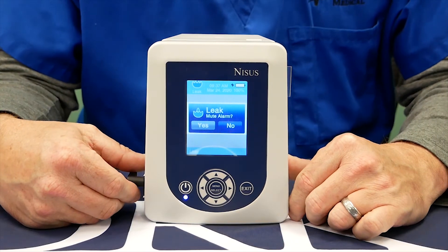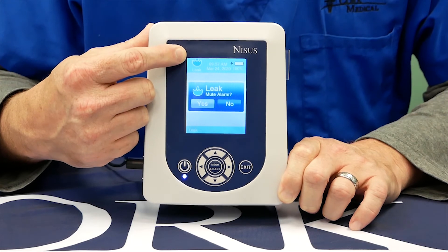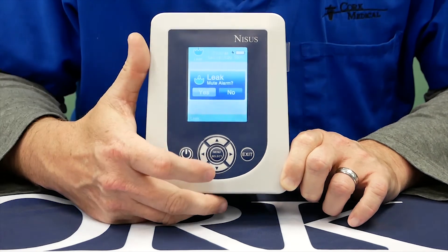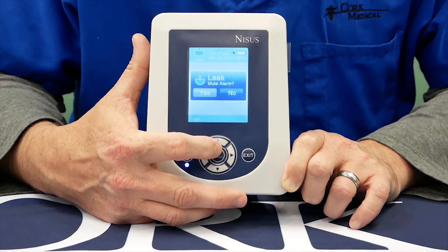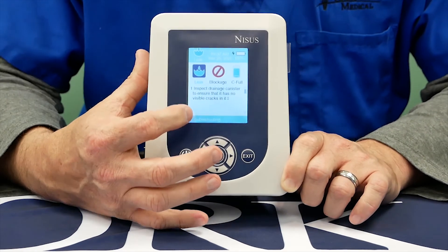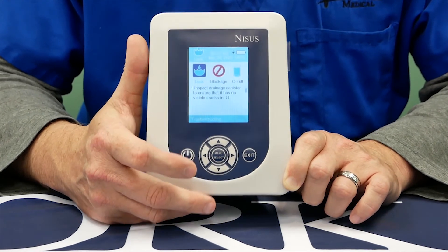One alarm that may occur during your therapy is called a leak alarm. It will be displayed in the header — you'll see a leak icon. It will also make an audible noise, and at this point you have the option of muting it for five minutes. Press mute, and then immediately after that, a troubleshooting menu walks you step-by-step through how to rectify that alarm, starting with number one, arrow down, walking you step-by-step how to fix your leak alarm.